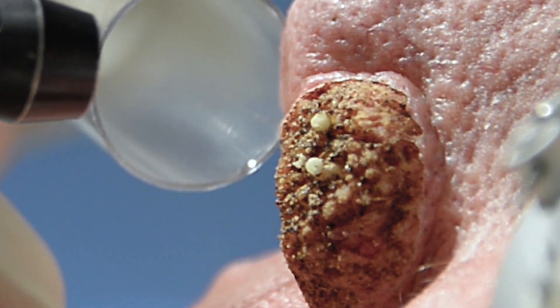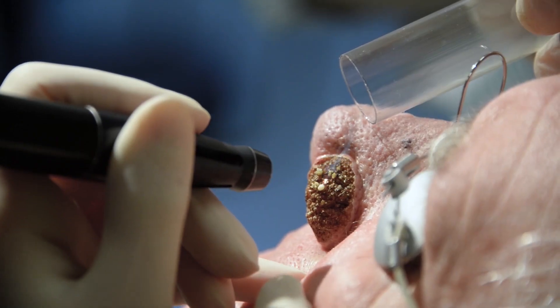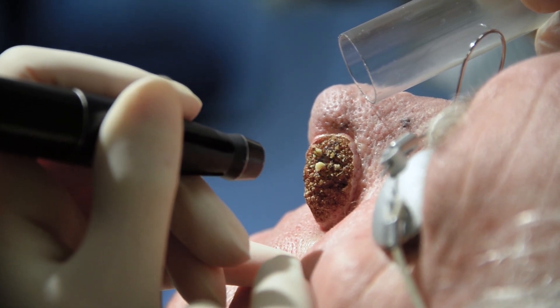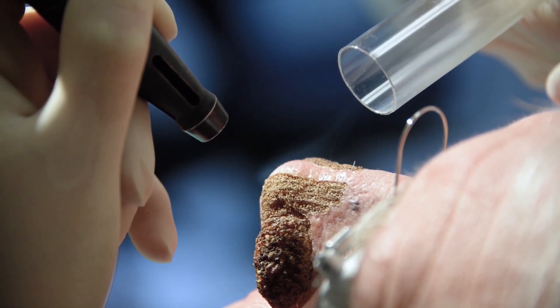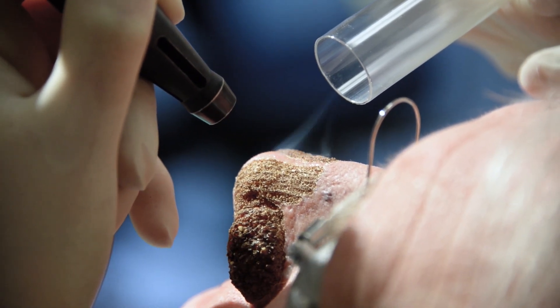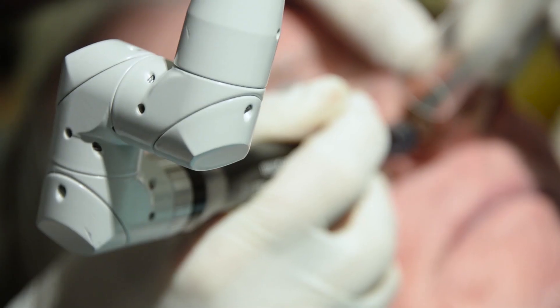As the bulk is reduced, it is important to progressively lower the energy to maintain control and minimize the potential of over-reduction and scarring. This usually follows a pattern of 8 watts, 6 watts, and 3 watts, until a satisfactory endpoint is achieved.